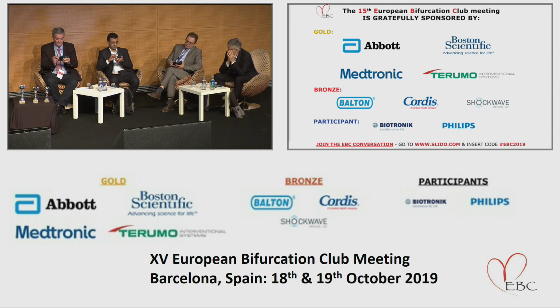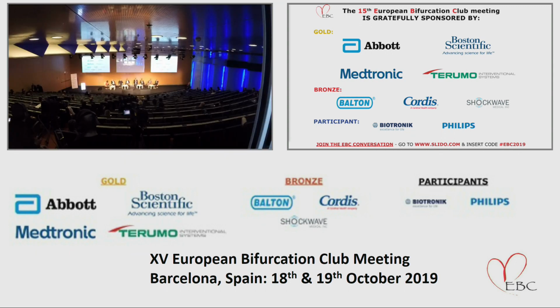Can I just make one comment just before the voting? I think when placing these ostial stents, it's really important to know the distance between the marker and the stent for the different manufacturers. That's really key, because it's the difference between a really good result and a not so good one, missing by 1 or 2 millimeters. So just be aware of those numbers for the 4 or 5 different stents that you're all using.